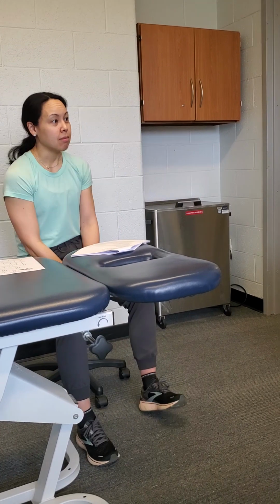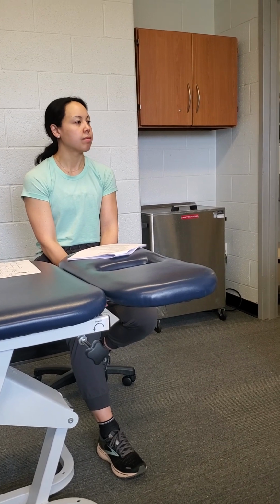But again, my experience is you do body weight of the movement that first session, because they're probably not going to tolerate this being on for that long anyways with just body weight. And then they know what to expect. And then the next time around, you add a pound maybe for the extension. Yeah, 2 pounds maybe, right?